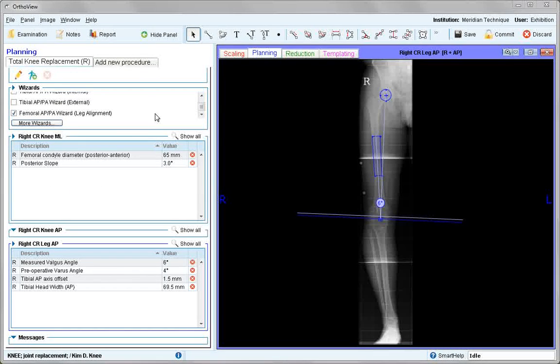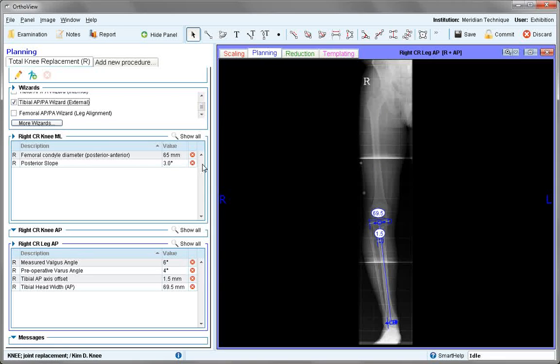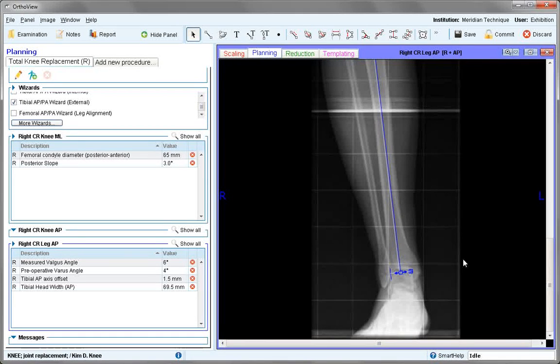Looking back at the full leg image, we can now review the tibial external wizard, used when you have an external jig for the surgical procedure. Remove the leg alignment wizard already seen and add the tibial external wizard, which has been pre-positioned. Zooming into the area, it sits across the tibial plateau and also the ankle.